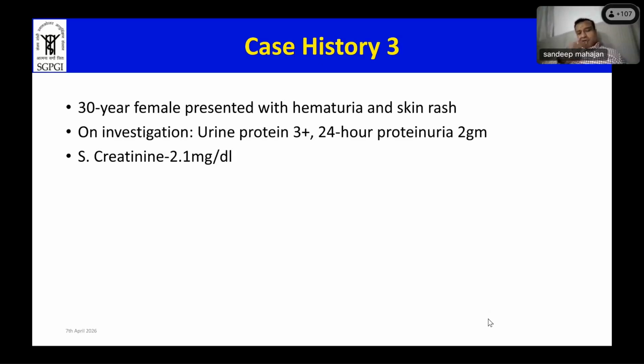Same with the tissue. The other thing, Dr. Vinita, I would like to have from you is the differential staining of the IgG pattern. You can have different subclasses of IgG which can still give you some lead, whether you are dealing with a primary or a secondary MGN. So even that can be a good lead. Then there can be a pattern where you have MGN predominantly with an FSGS pattern. That would be those cases which would be more difficult.